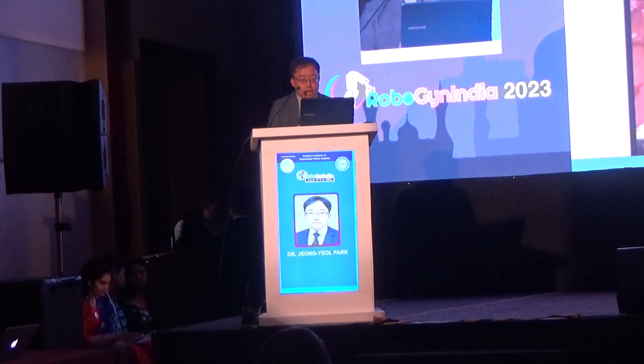I perform a robotic hysterectomy for staging purposes. Usually, I cut the anterior and posterior fornices first and then cut both uterine arteries to secure the uterine artery well.